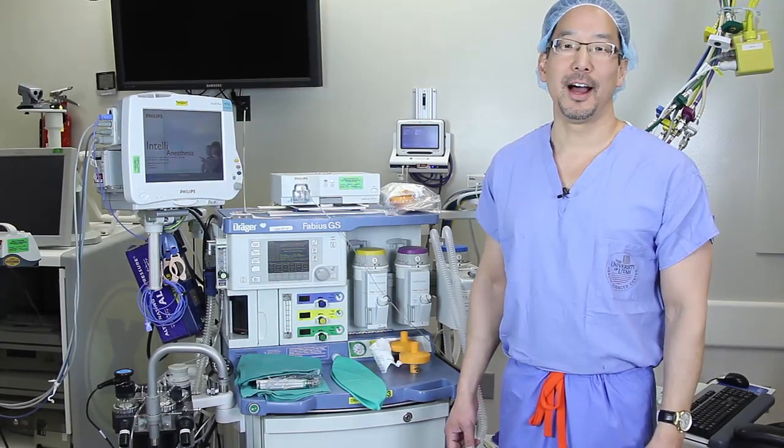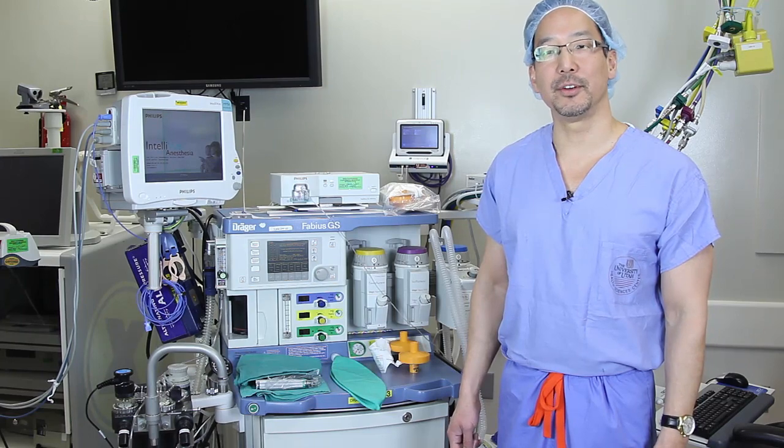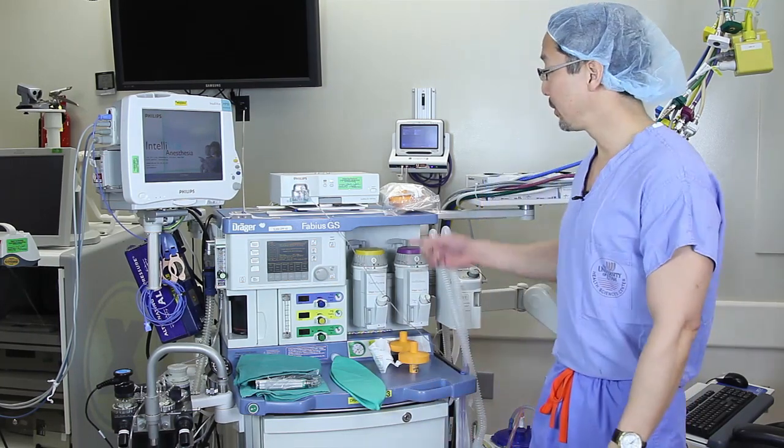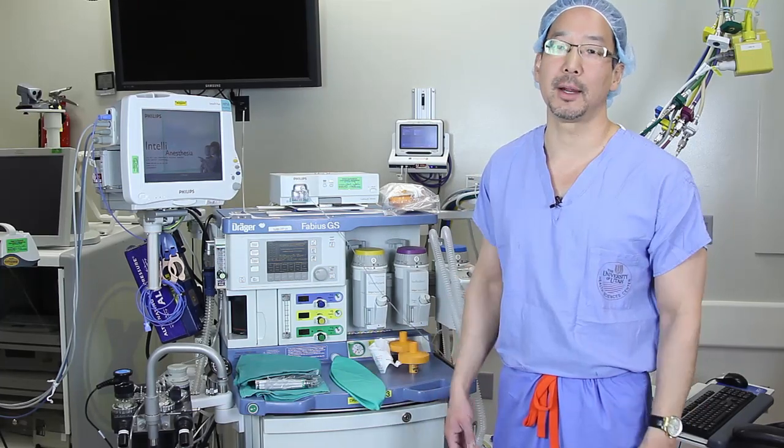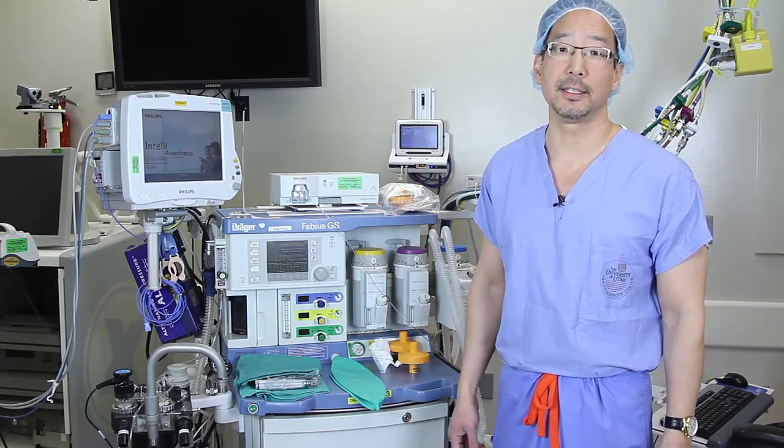Hello, I'm Dr. Derek Sakata. I'm a clinical anesthesiologist here at the University of Utah. Today I'll be showing you how to prepare your anesthesia workstation for patients who might be predisposed to malignant hyperthermia and be able to do that in less than 90 seconds.